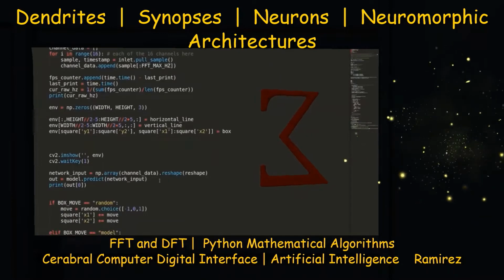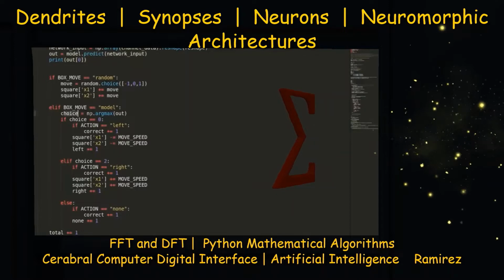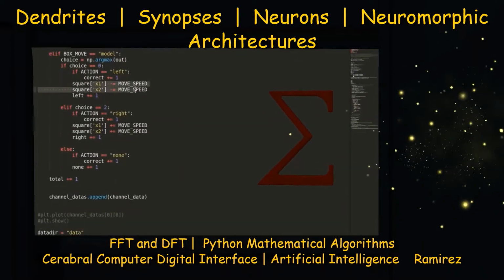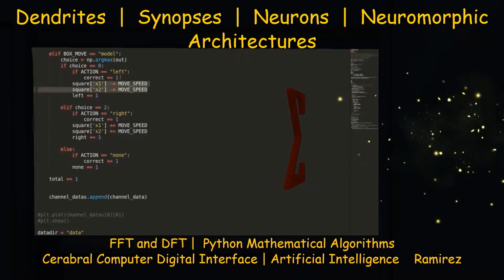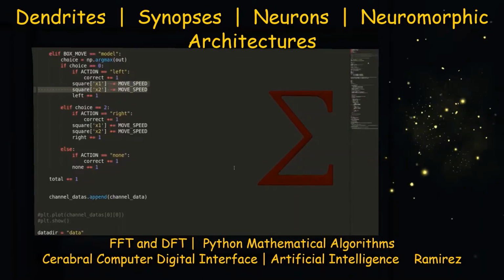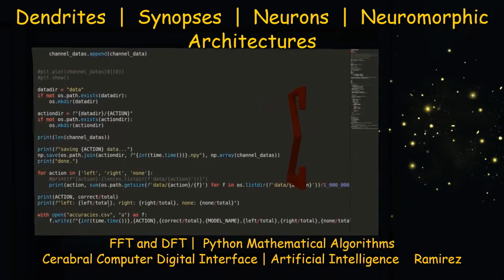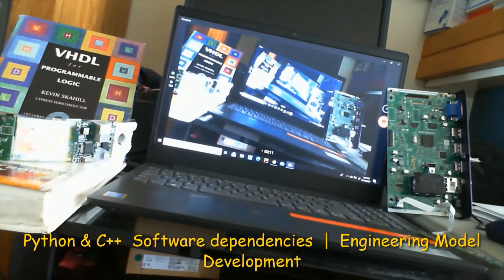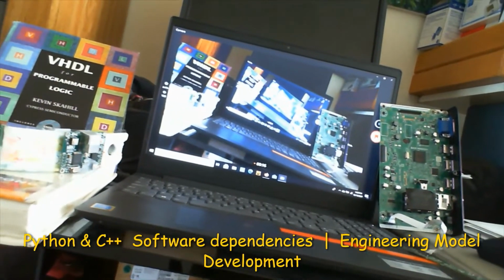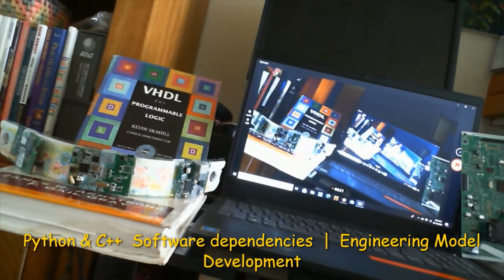These EEG signals are training examples or training sets. Based on these training examples, the classifier will be tuned in order to recognize as appropriately as possible the class of the training EEG signals.